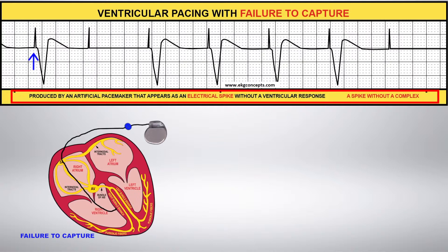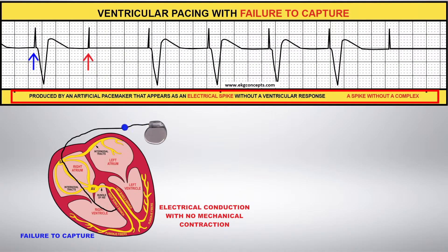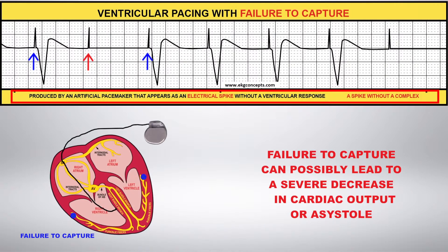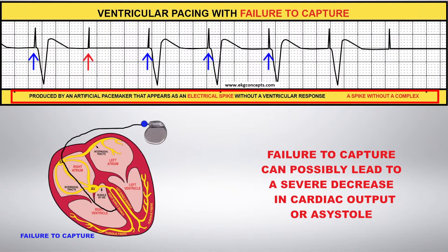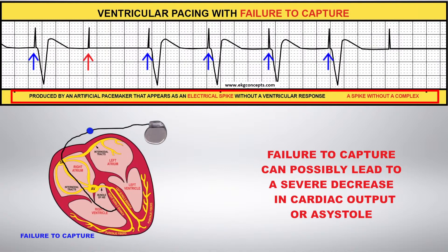In this example, the blue arrows represent electrical conduction with mechanical contraction, and the red arrows represent electrical conduction with no mechanical contraction. Failure to capture can possibly lead to a severe decrease in cardiac output or asystole.